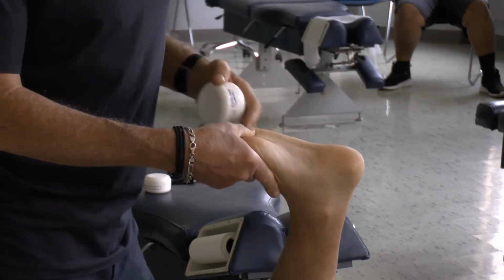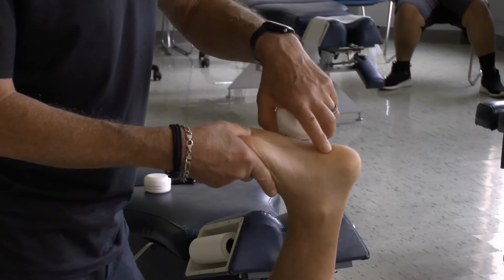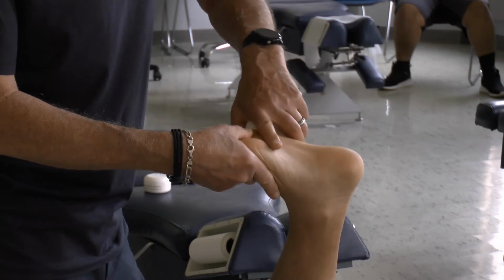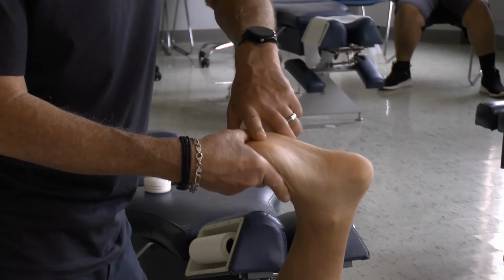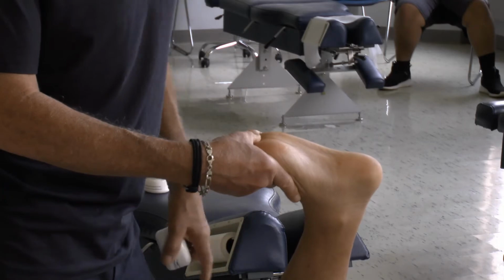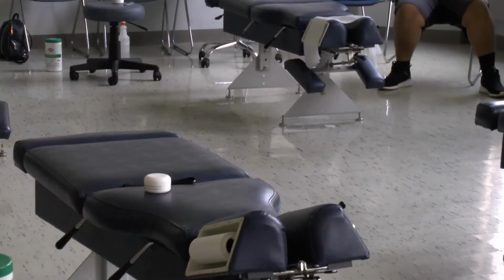The usual site of irritation is where the plantar fascia inserts into the medial aspect of the calcaneus. This is a very tough fibrous band that crosses the entire bottom of the foot and inserts into all of the metatarsal heads and metatarsal phalangeal joint area. So we want to stimulate circulation into this region and perhaps even stimulate an inflammatory response.